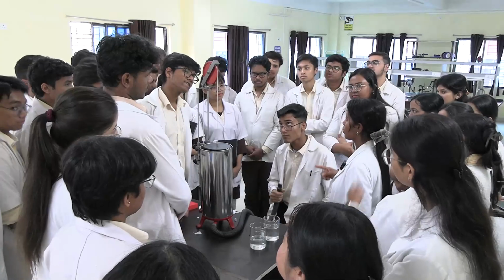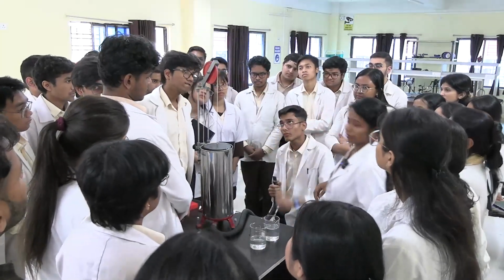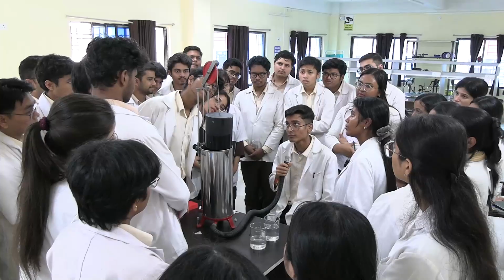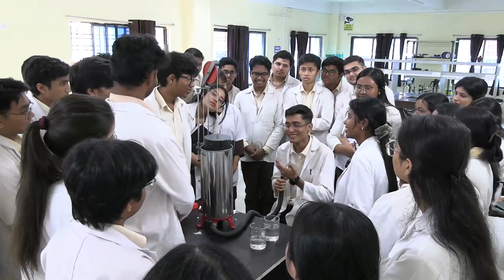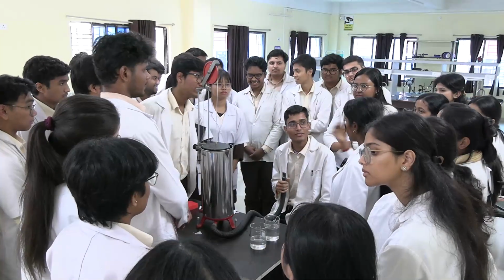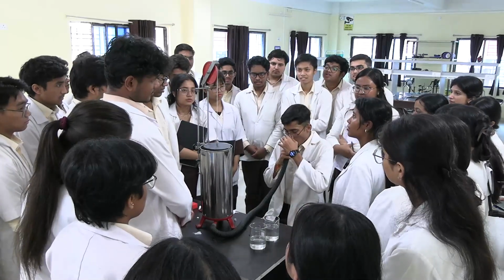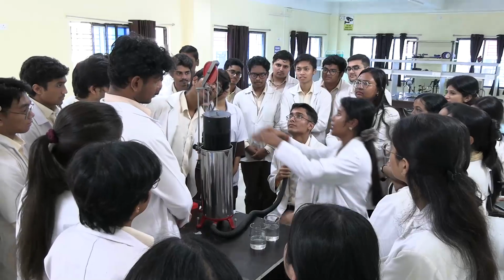You can know the difference now. 4,000, still 4,000. You take inspiration without looking at that, and force it out. Okay. So I think it will be more than 4,000. I feel like that. It's stuck. It's stuck.